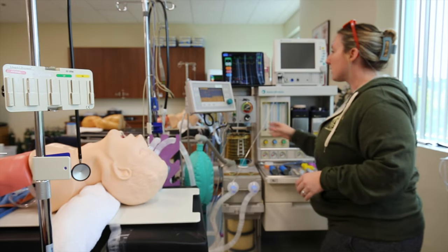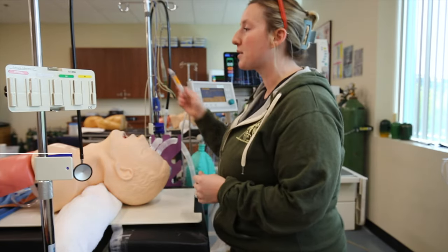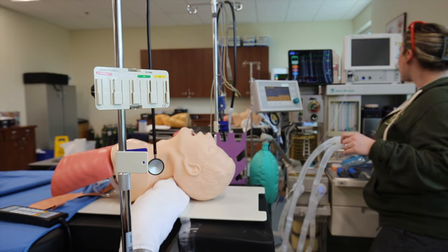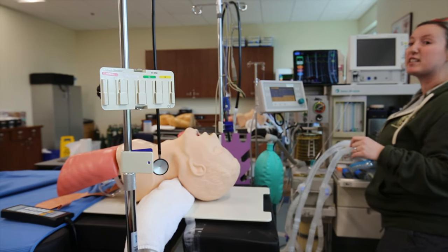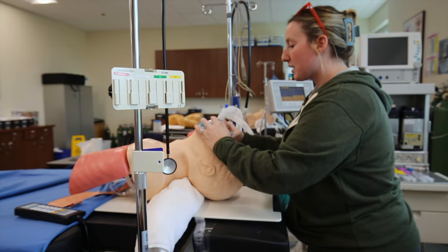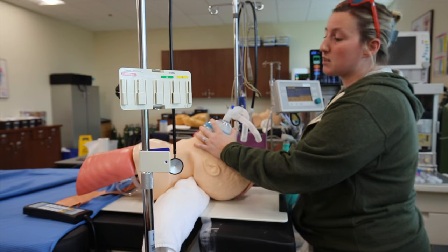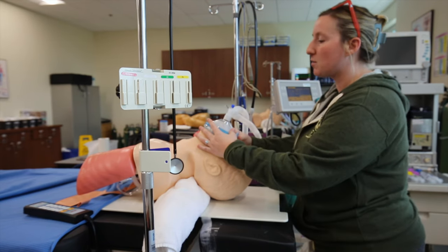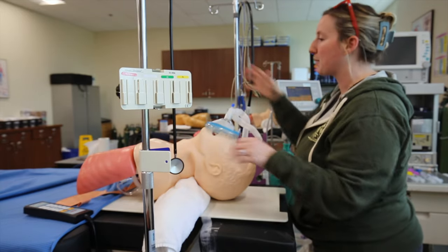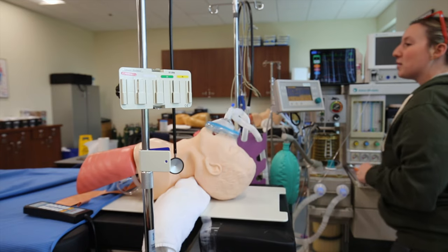The patient is coming over. They're scooting over by themselves. As they're scooting over, I'm going to give them 2 milligrams of Versed. As they're getting comfortable, I'm going to turn on my oxygen at 5 liters per minute and pre-oxygenate them for at least 3 minutes. I'm going to encourage them to take deep breaths — this mask is on very lightly, just giving them a big chin lift, face up towards the ceiling. I'd have someone hold the mask while I put my monitoring equipment on — blood pressure cuff first, cycle a blood pressure, EKG leads and pulse ox. We're getting fresh vital signs. I'm going to go ahead and give my fentanyl and my lidocaine.